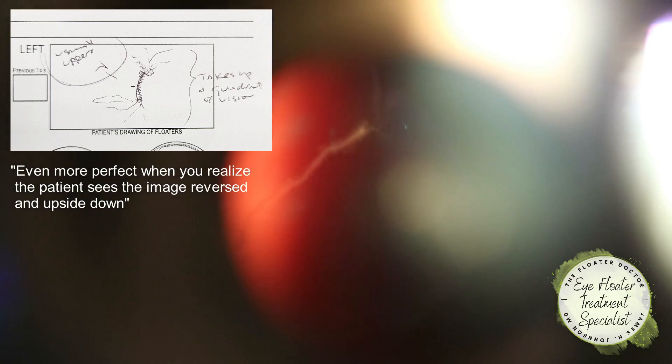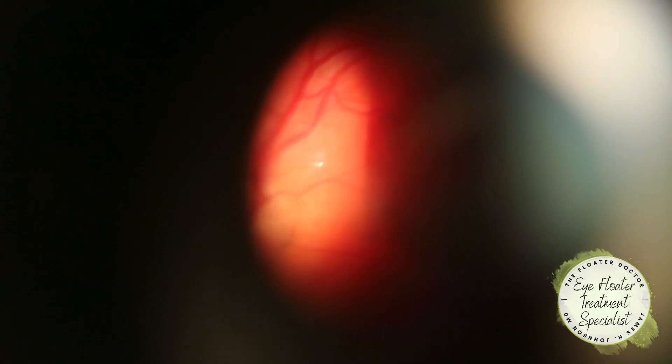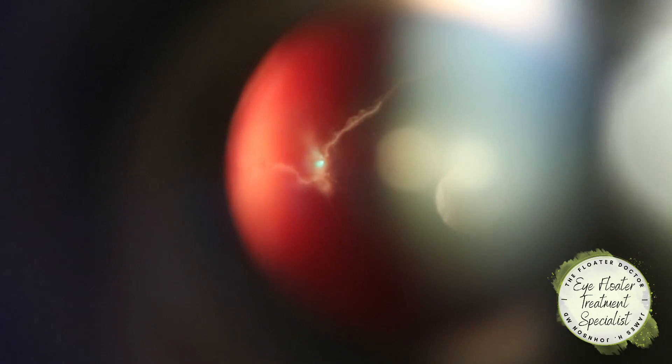So the good news about this, this is fairly anterior, towards the front half of the eye. We're nowhere near the retina, which is way back there. And I have my two little green lights. When those two lights are lined up on top of each other, that's where my precise focus is.